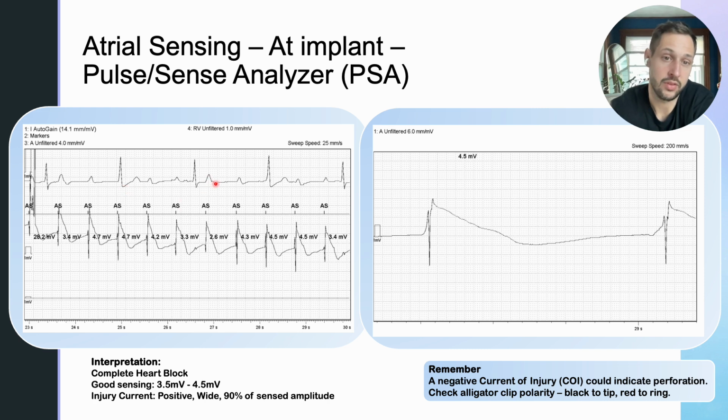This T wave is tall, same thing. That's a little bit of fusion here on the EKG, which is making it look like it's a tall T wave, but there's a P wave buried in there. We see our rhythmic P waves. We see our injury is almost 100% of our injury current.